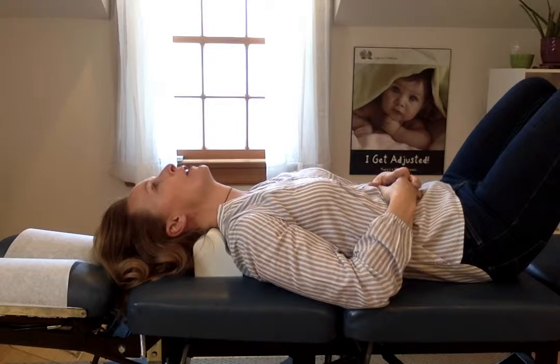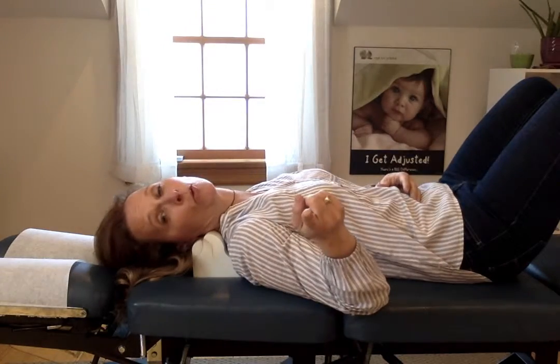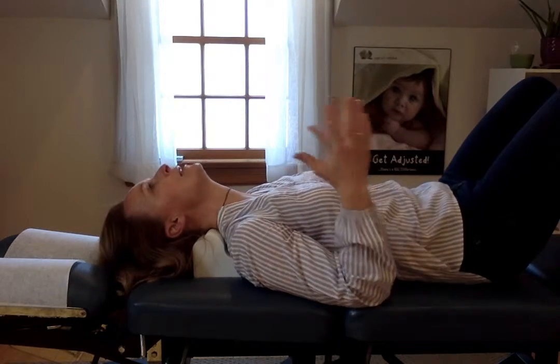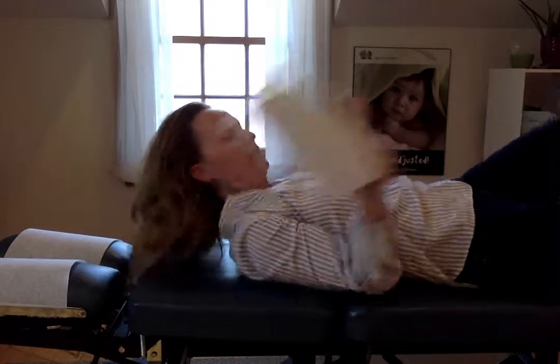Notice where my eyes are facing. My eyes are facing straight up. They're not over here watching Netflix or whatever else is keeping you entertained. It's kind of boring. You have to look straight up. If your head is tilted or turned in any different way, then you're not getting the right curve correction. Okay, so I'm going to sit up here.